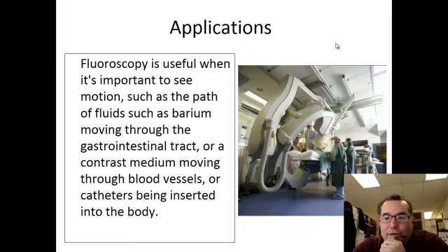The image intensifier unit that we'll talk about and you'll see in the next few slides kind of looks like a big cylinder, whereas you can tell that there's a flat panel detector if you see a sort of square rectangle up here. Right, so our x-rays are coming from down here. Here's our x-ray tube, through the patient onto this and captured by the flat panel detector.